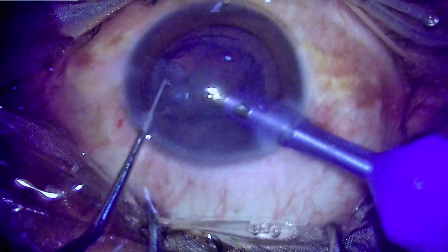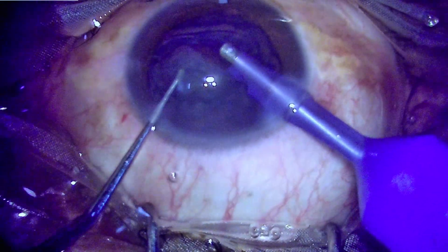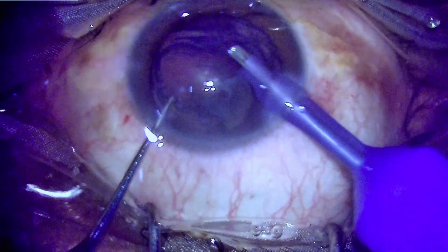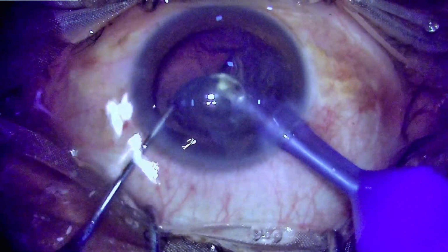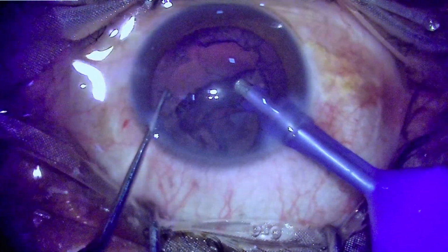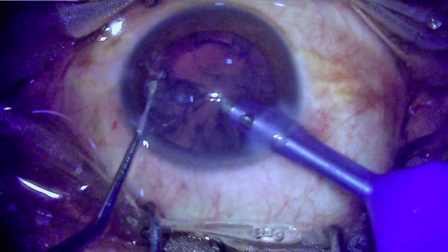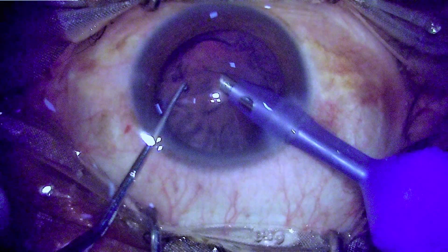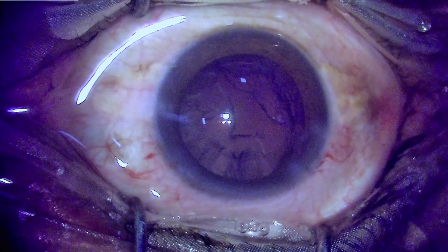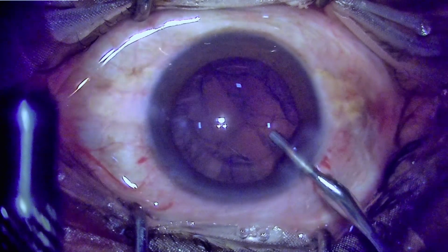These kinds of nucleus, which are small and soft, can usually get prolapsed into the anterior chamber, but because they are not too bulky and the phaco power required is too less, there is usually no threat to the endothelium. Removing the epinucleus just like that by aspirating it, pulling it out of the bag, and it comes into your phaco tip very easily. Very minimal phaco power is used for removing these kinds of soft cataracts, so there's nearly no collateral damage. We can appreciate the illumination is still kept low, and we are working nearly under retroillumination only.